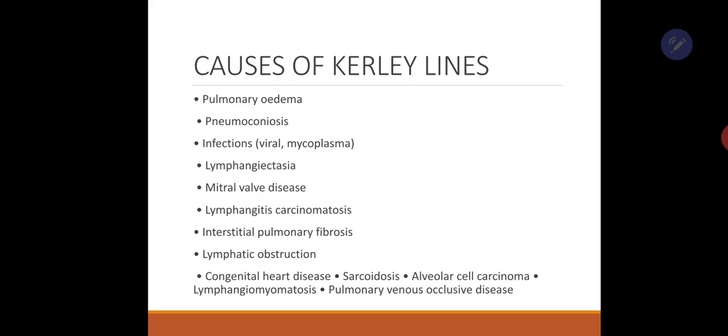Causes of Kerley lines include pulmonary edema, which we see very commonly on a day-to-day basis. Pneumoconiosis is rare. About pulmonary edema, you should always keep in mind: next time you see a patient of pulmonary edema, look for Kerley lines.